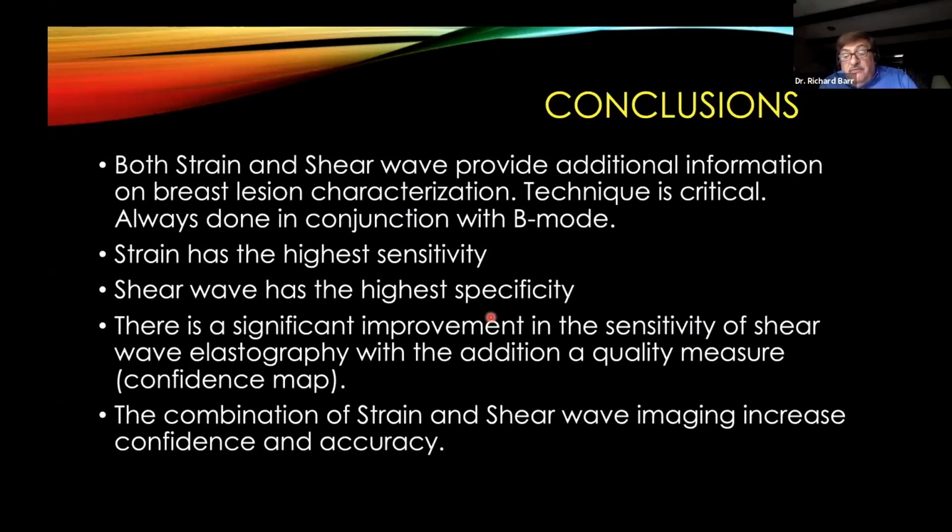Well, for liver lesions, the cutoff values are going to be different for every organ. For liver, the problem is that there are stiff hemangiomas and soft hemangiomas. There are stiff HCCs and there are soft HCCs. So in general, yes, malignant lesions are stiffer and benign lesions are softer, but in any given lesion, you can't really tell with high confidence if the lesion is benign or malignant.